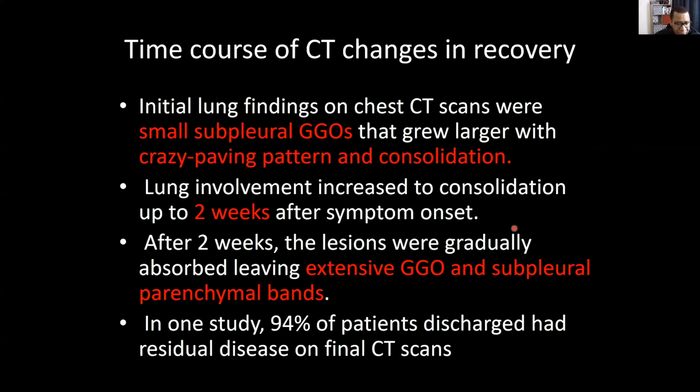Because we know a lot of times ground glass opacity is due to infiltration of the septum. The secondary pulmonary lobule has a septum that surrounds it, and people call that the interstitium, right? So sort of like an interstitial edema kind of thing, right? But as you infiltrate into the alveolar spaces, so like we talked about, when you have loss of integrity of the endothelial and epithelial barrier, you flood fluid and hyaline membrane into the alveolar spaces, and this typically results in more consolidation. So this takes some time.